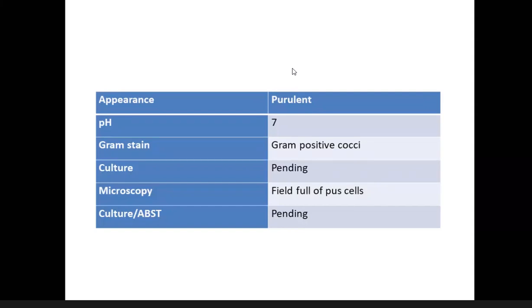Sir, I have a question. In clinical practice, if someone develops bilateral pleural effusions visible on chest X-rays, not only like in this case, the first X-ray, if it's bilateral, how are we going to think about the management plan?